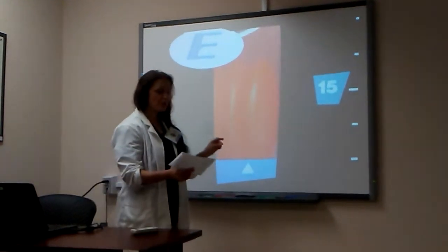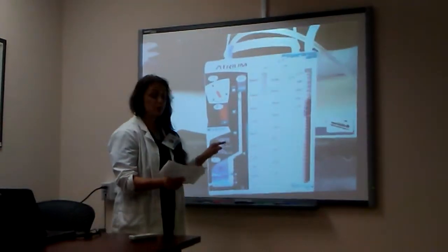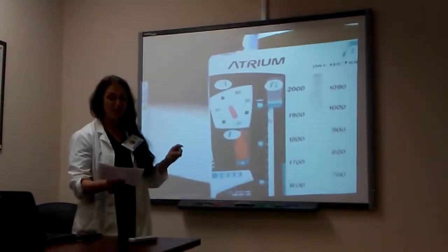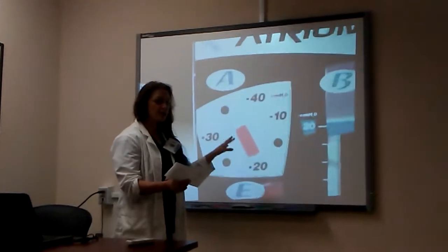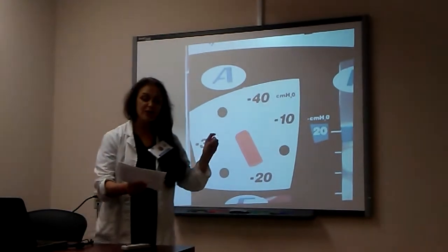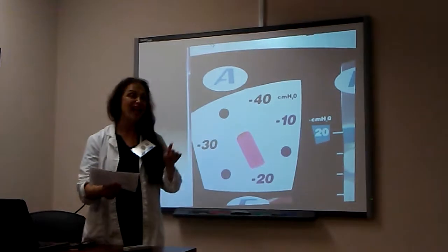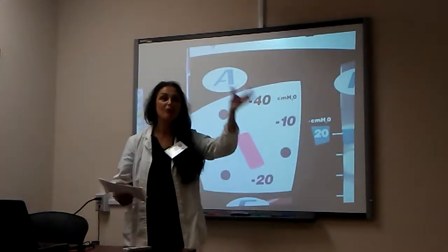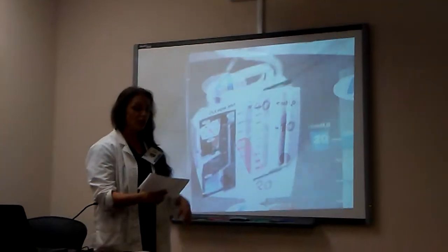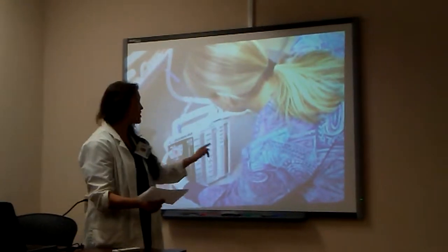Post-procedure, you're going to make sure that the patient deep breathes. You should have taught them how to use the incentive spirometer prior to surgery. You're going to keep checking the water seal every 2 hours. You're going to document the drainage the first 24 hours and then every 8 hours. Let me repeat that. You probably see a lot of drainage initially. So you're going to document the drainage the first 24 hours and then every 8 hours.